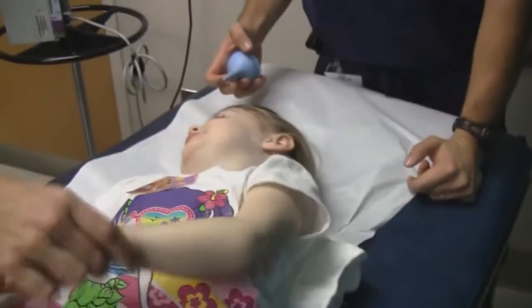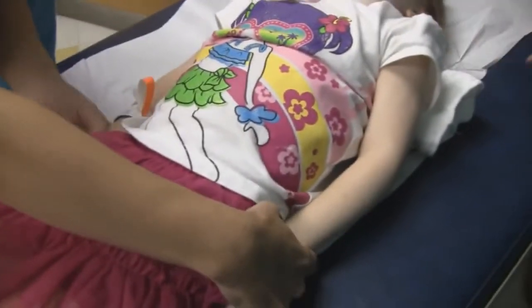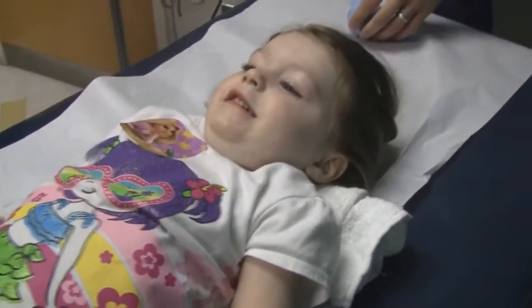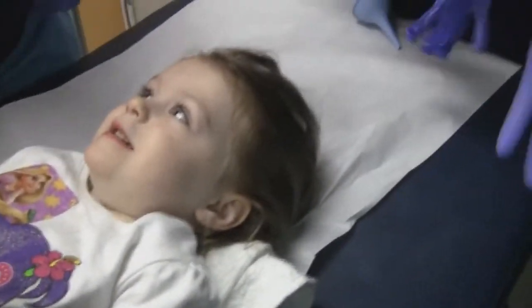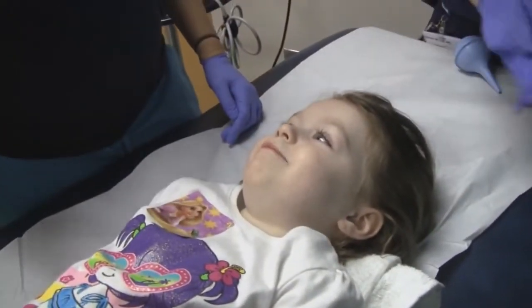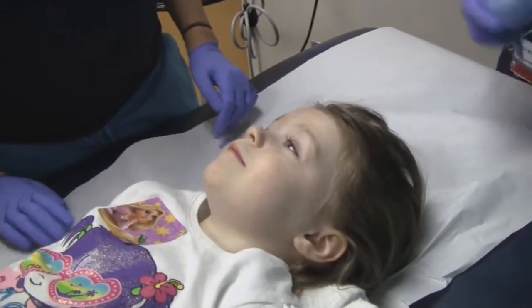Alright, so let's orchestrate this. Put your hands down there, maybe even under your bottom. Grab your bottom. Sit on your hands. Good job. And if you hold her there, we'll hold above her knee so that she doesn't fulcrum against and kick away. Alright, Rachel, you'll cover the mouth at the right time. Not right now — don't want to freak her out.